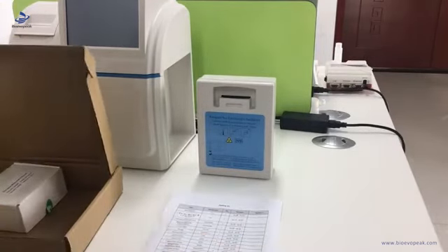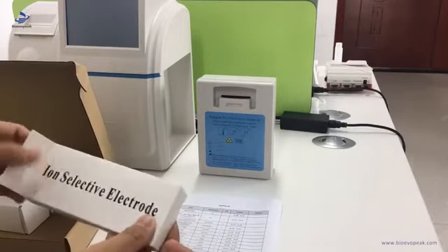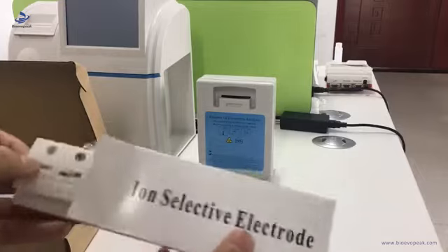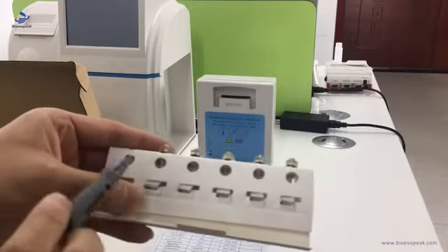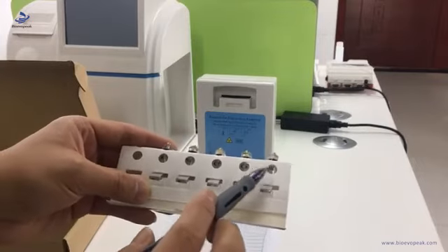For example, we take out the normal electrodes and show them to the end users to check each one: potassium, sodium, chloride, pH, and calcium.